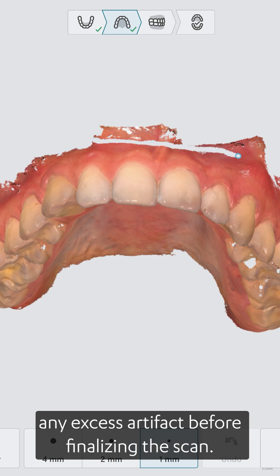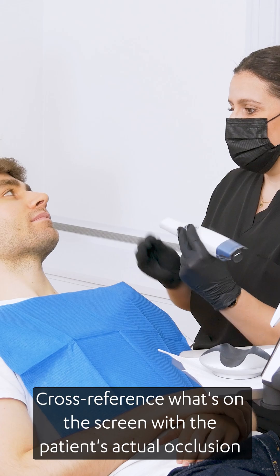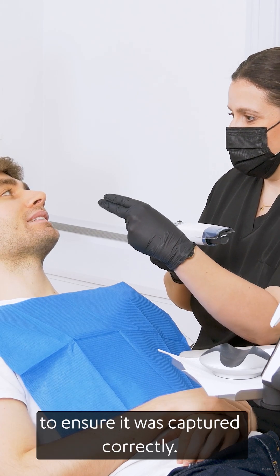Use the trimming tool to remove any excess soft tissue or artefacts that could interfere with the bite registration. Cross-reference what's on the screen with the patient's actual occlusion to ensure it was captured correctly.